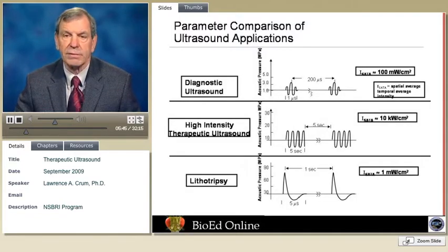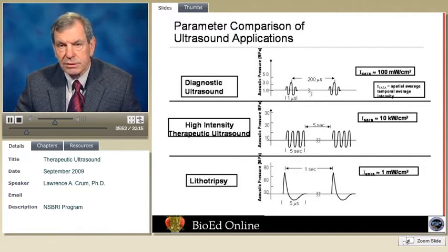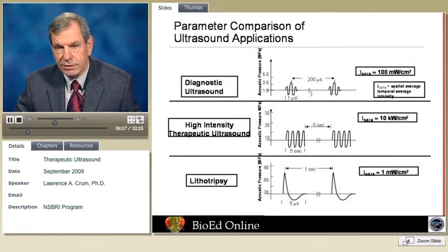First of all, let me give you some background about therapeutic ultrasound in comparison of this technology with other technologies. It might be interesting to note what the acoustic waveforms are that comprise these different technologies. So for diagnostic ultrasound, one typically has a pulse echo sequence in which one shoots a small pulse into the body and then waits a time period until that pulse is reflected. And you use that reflected pulse to form an image of the area that's illuminated.